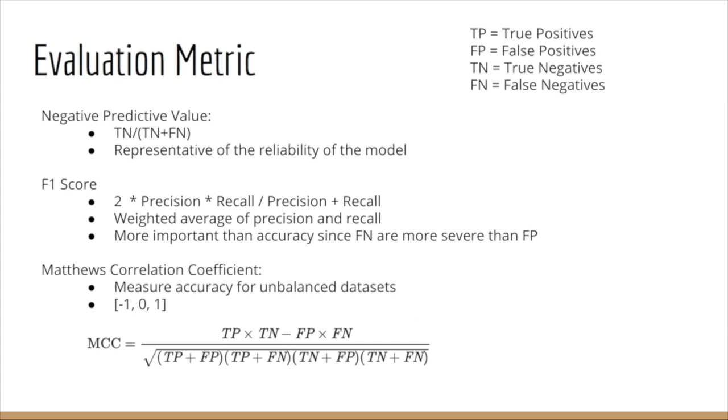The F1 score is a better indicator of accuracy than vanilla accuracy in our problem, since the severity of having false negatives is higher than that of false positives. A false negative will send a sick patient home, whereas a false positive simply requires a healthy patient to be further verified by a specialist. Therefore, we must pay closer attention to this metric.